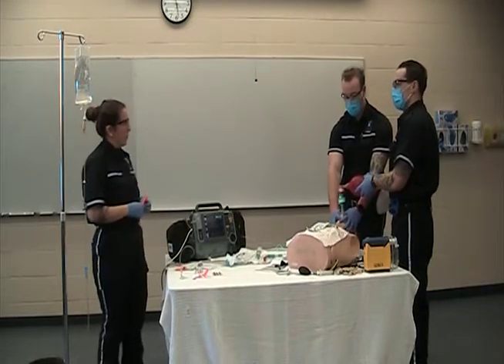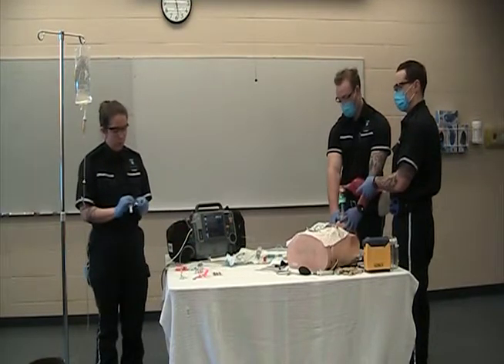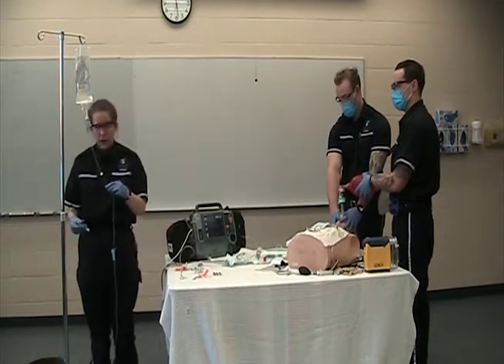So at this point, is our patient appropriately sedated? They are. They are, perfect. So we'll move on to succinylcholine. So the paralytic agent is also pushed over 30 seconds. It takes between 60 and 90 seconds to work.